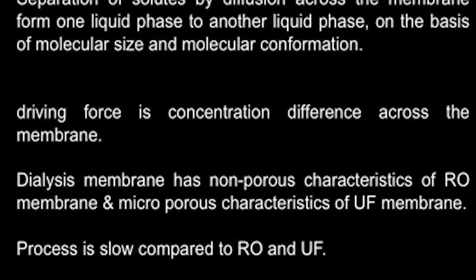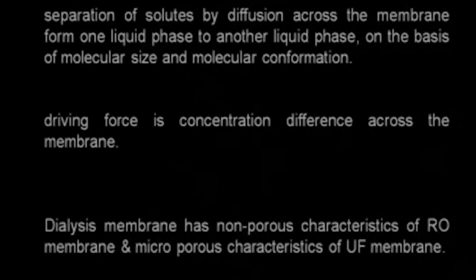So the process is very slow. Normally the patients who go for this type of dialysis treatment have to spend 4 to 6 hours. It is a very long process. If somebody has to do dialysis every month, imagine the person has to spend more than half a day lying down, connected to a dialysis machine. So if it can be speeded up, then people will be very happy.